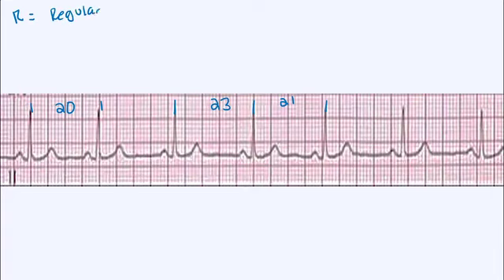If I were to have, let's say, 20 boxes from this R wave to this one, and then 32 from this R wave to this R wave, that would be irregular. But in our strip here, we are regular.